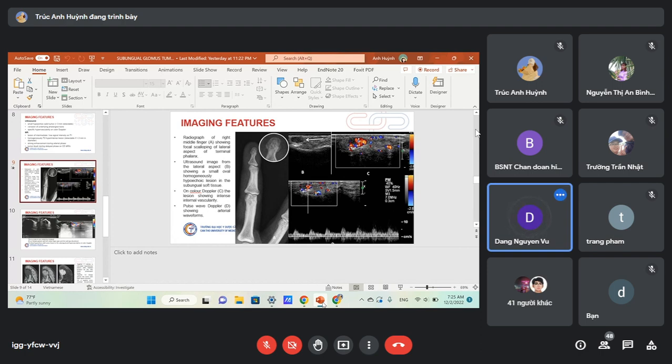Okay. So on the radiograph, you describe the change of the bone, and after that you can suggest the ultrasound and the MRI. Combine that with the clinical symptoms, then you may have the suggestion. You may suggest an ultrasound. You can do MRI, and you see the nodular vasculature.